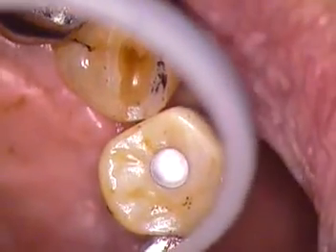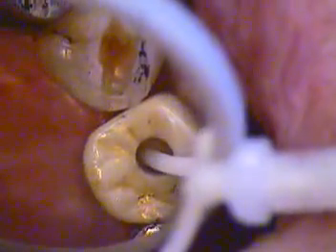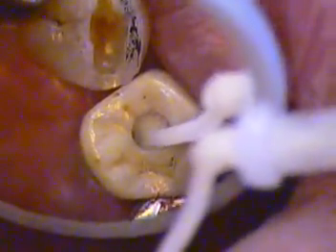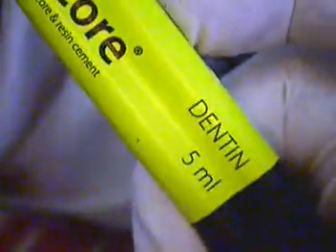Rich can go enjoy eating steak tonight — or chicken and fish. This is self-cure, dual-cure, light-cure, dentin shade. Keep the tip in there and just inject. I like this ParaCore — I'll leave a little bit out there to show you. This is our material from Coltène Whaledent called ParaCore. I like the shade Dentin. You just inject it through that tip, and it's light-curable, so we can speed things along and make it adjustable.